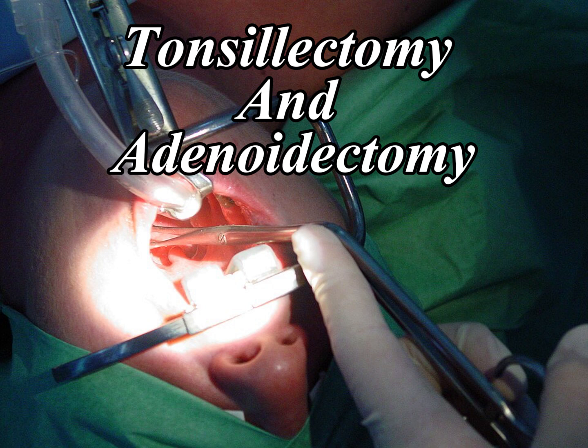Step 3. Adenoidectomy. After tonsillectomy, the mouth gag is repositioned, or a nasopharyngeal mirror is used to visualize the adenoidal pad on the posterior nasopharyngeal wall. Adenoid removal is performed using a curved adenoid curette with a guard or suction electrocautery for a more controlled hemostatic resection. Tissue is removed in a scraping downward motion, often in multiple passes.